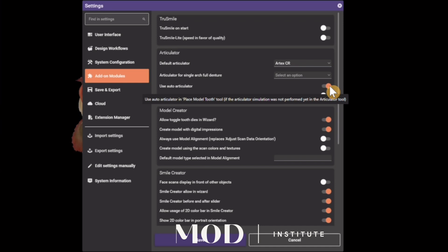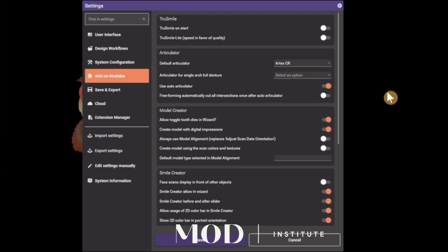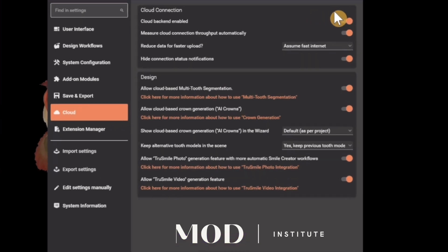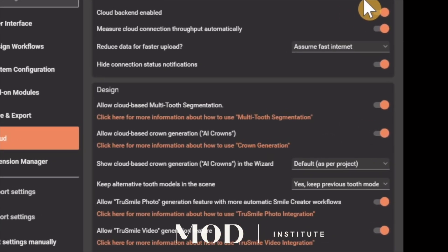Secondly, go to the Cloud button — that's going to enable you to activate all the cool new AI features. Both the cloud connection and in-design features. I just turned everything on there and we've basically unlocked some amazing features in ExoCAD.